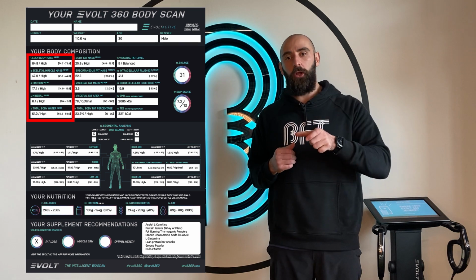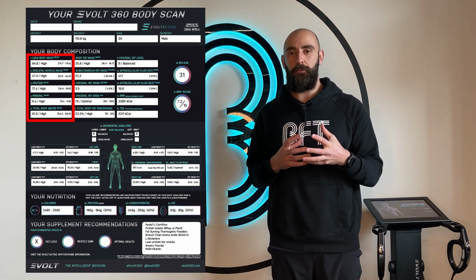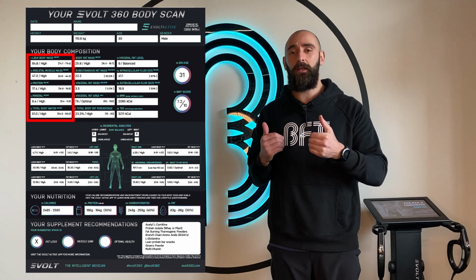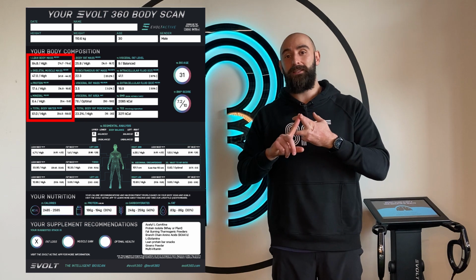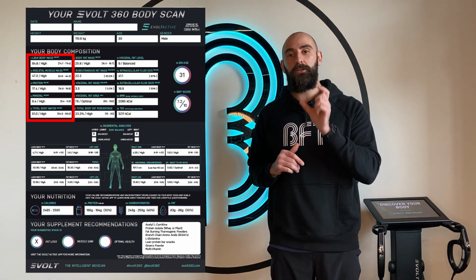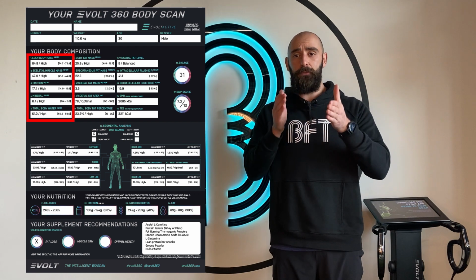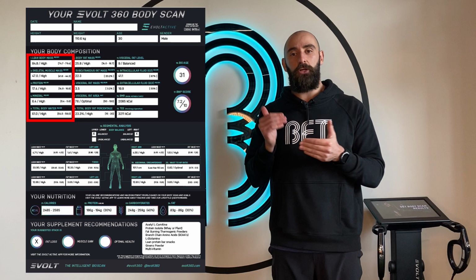So the first column on the left-hand side, you're going to see everything pertaining to lean body mass and skeletal muscle mass. So that skeletal muscle mass is a really good indication of your longevity of life and health. Having a good amount of skeletal muscle mass is really important for injury prevention, for strength, and for bone density. So you'll see in the brackets just next to those main numbers, there'll be an optimal range for your personal stats. And then next to that, in the main column of it, you'll see what your numbers are and whether you're sitting in the optimal range, high or low. So it's just an indication of where we can sort of adjust our focus should we need to.